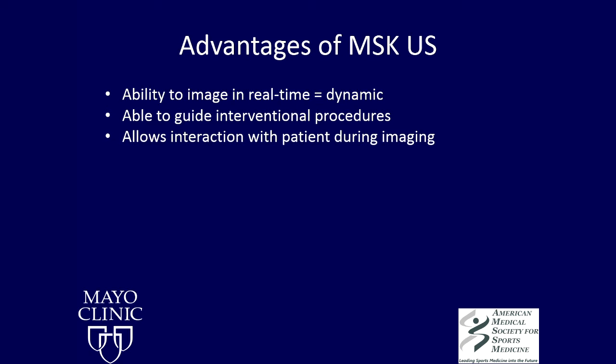Another very nice thing is that it allows you to interact with your patients while you're imaging. So you perform the history and physical examination, and then you have your ultrasound machine. You can use it to look for specific pathology, and you can talk to the patient while you're doing that image, and you can point out on the screen exactly what's going on, and patients love that.